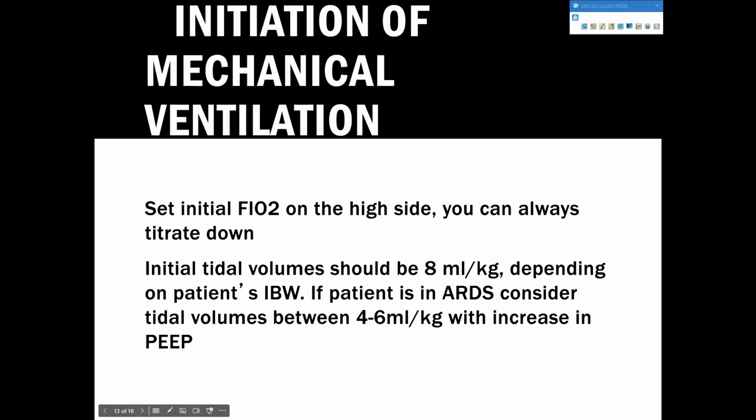Another way to do it is, if there's no indication for this patient, let's say a surgical patient, to have any lung issue, you can keep taking your FiO2 down by 20. So you can go from 100 to 80, hang out, do a vent check, do your mouth care, do some other stuff. If he's still 100%, remember that old oxyhemoglobin curve?